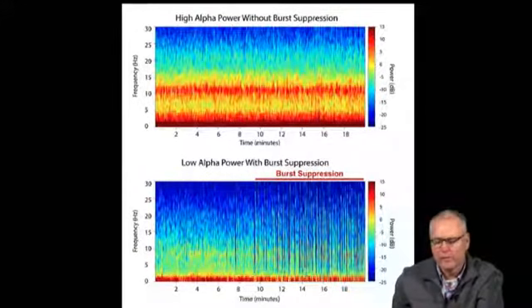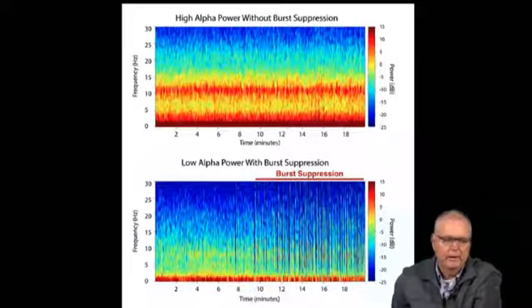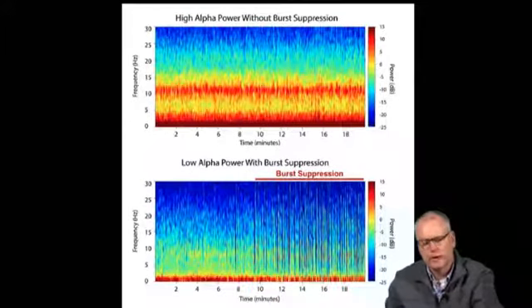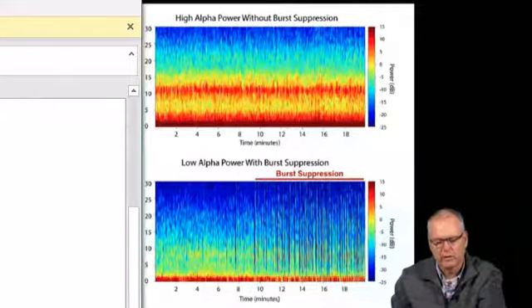And perhaps that's the piece that's missing for us, because what matters is how the patient does after they wake up. And frankly, after they wake up, they're off our radar screen. We don't look in on them and check how their brain function is. We're not familiar with the tools on how to do that. And cognitive dysfunction can happen days and weeks afterwards. And I think it's high time we start looking into that. And this is perhaps a tool to help calibrate us on how we can approach people who have a vulnerable brain and adjust the titrating of our anesthetics accordingly.